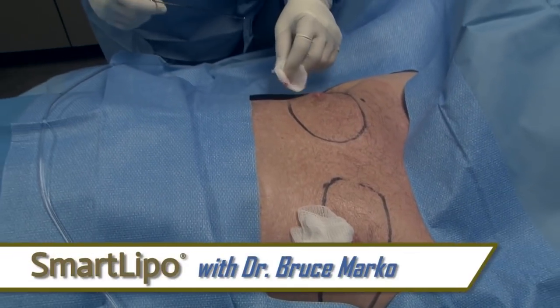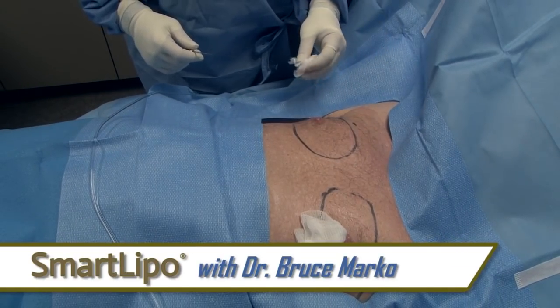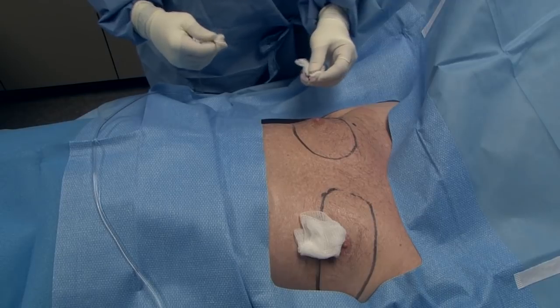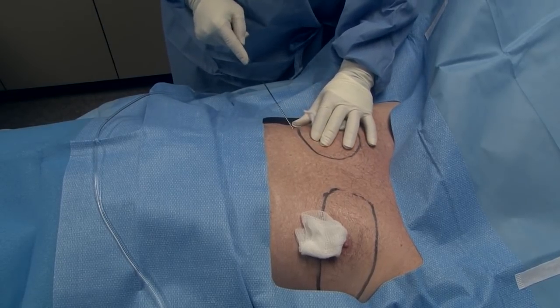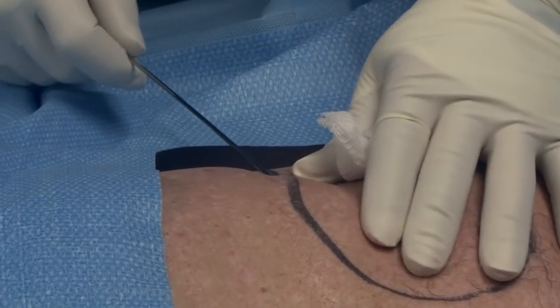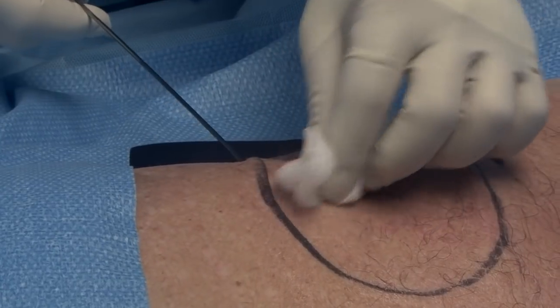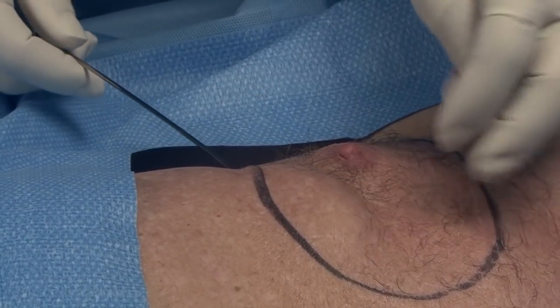The next step then is to, through the little opening, put the numbing medicine in the rest of the area. This is done with this tiny little, what we call cannula, a little tube. It goes right underneath the skin and then that delivers the numbing medicine. This is called a tumescent solution, or liposuction under tumescence.